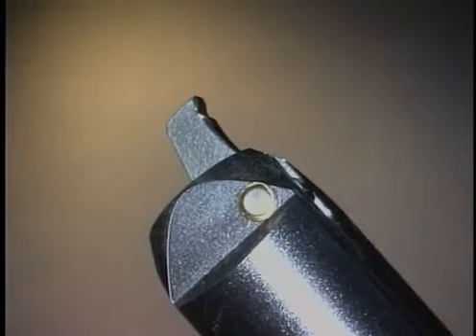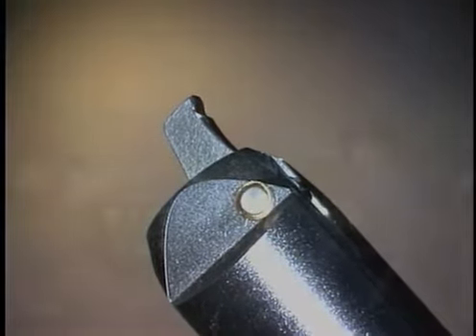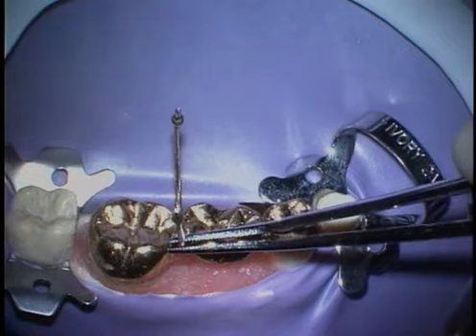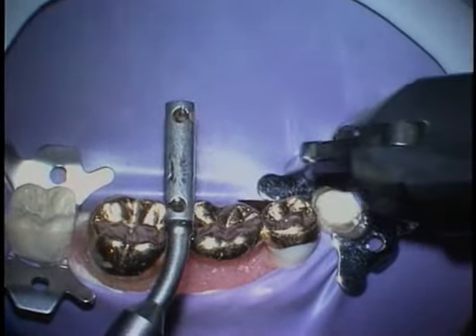Brushing a finger across the activating trigger delivers intermittent pulses of air to the hammer. The hammer delivers effective energy as it accelerates over a short distance. A loop is selected and is passed under the solder joint and is positioned as close as possible to the abutment tooth. Each end of the loop is firmly attached to the loop holder.